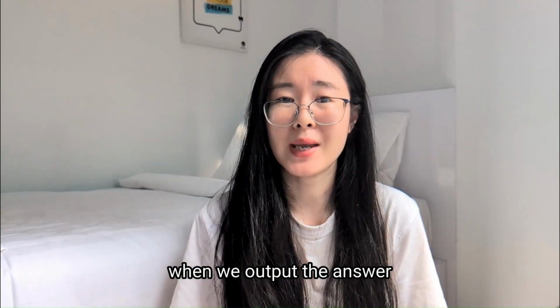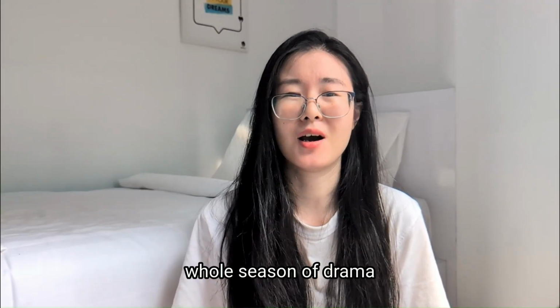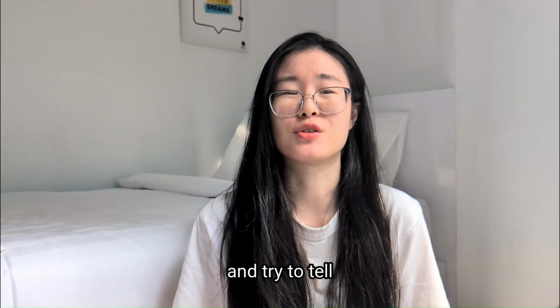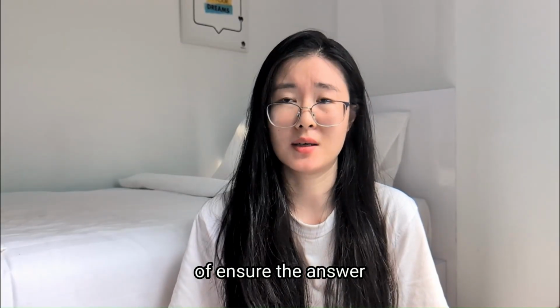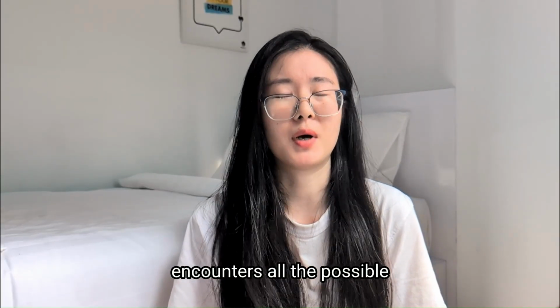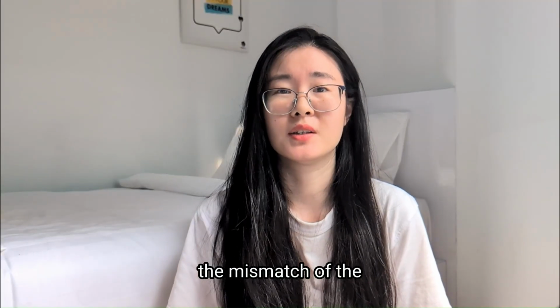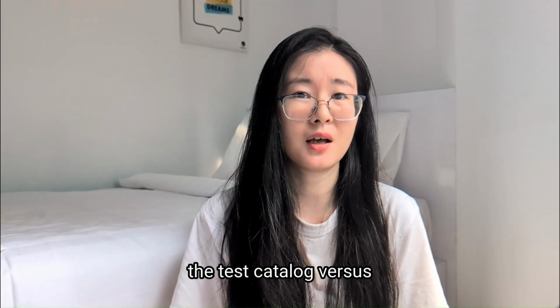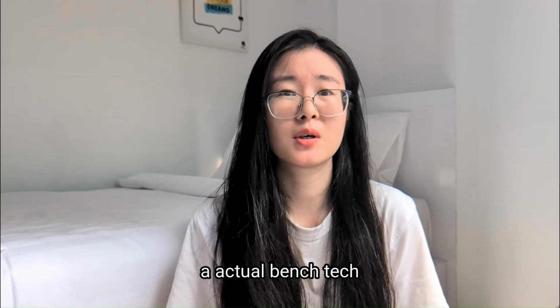But when we give the answer, we actually play a whole season of drama in our head and try to tell you the minimum volume to ensure an answer that accounts for all the possible plot twists. That is what causes the mismatch between the volume you see on the test catalog and the volume we say on the phone as an actual bench tech.